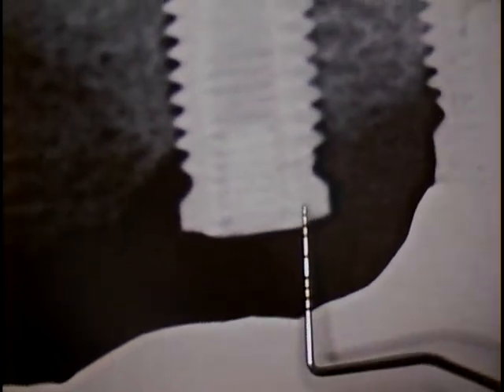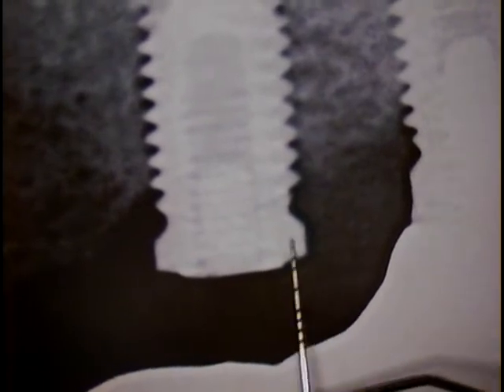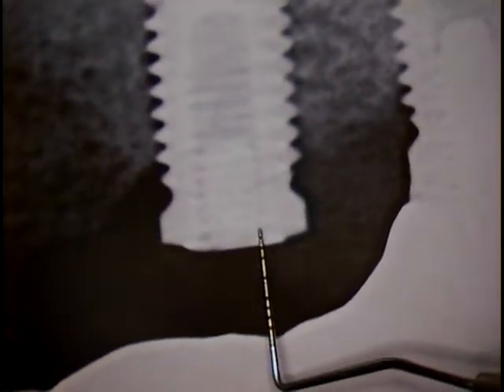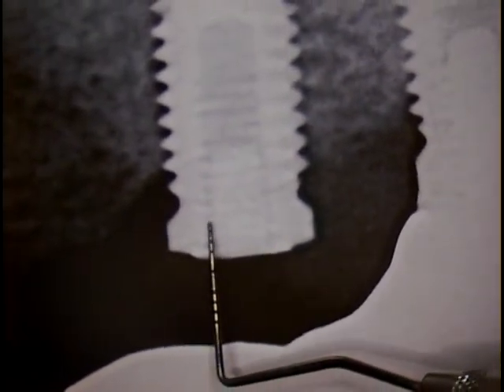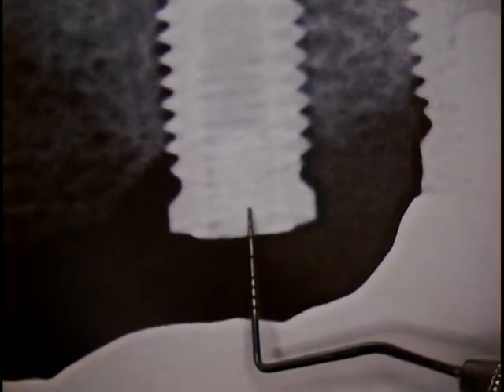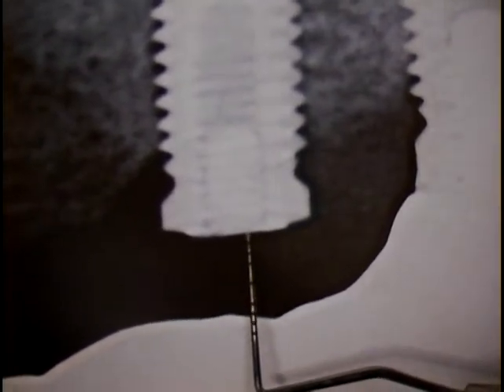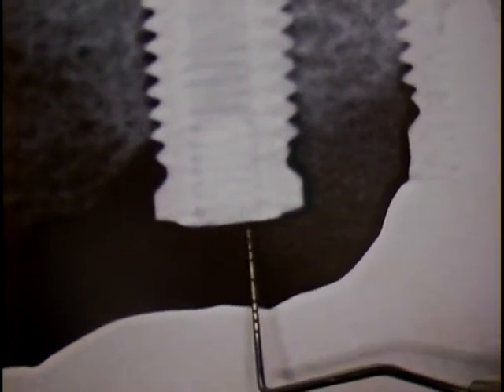Good news. Just from the x-ray, it looks like we have a nice rim here. We really don't know truly if there has been prior access or someone has already made an attempt, so we're going to find that out by visualizing the topography of the fracture itself. We're also going to pre-soak the area after we gain access to the fixture. The next step is to expose the fixture now.